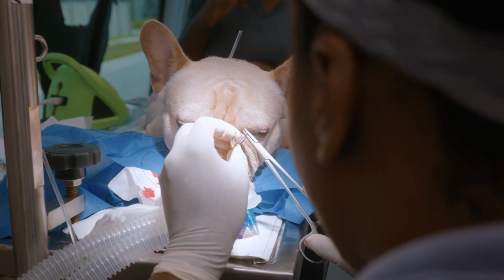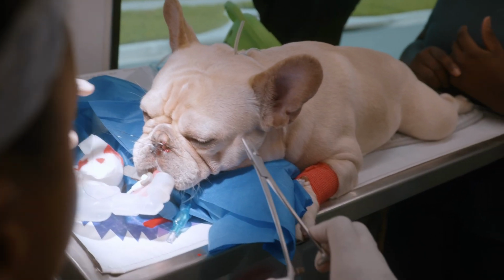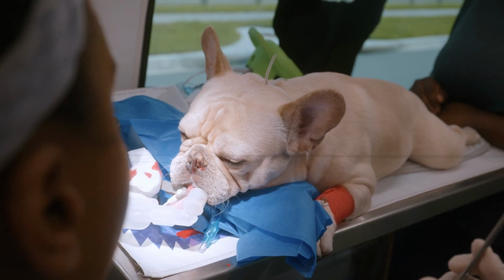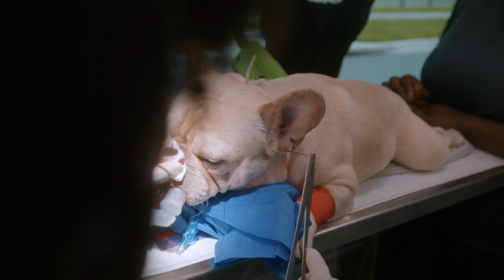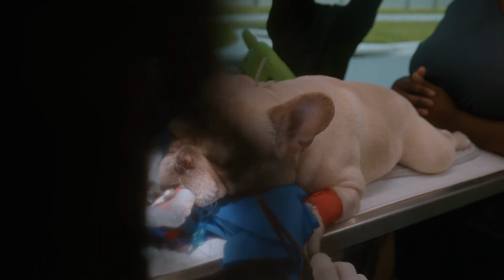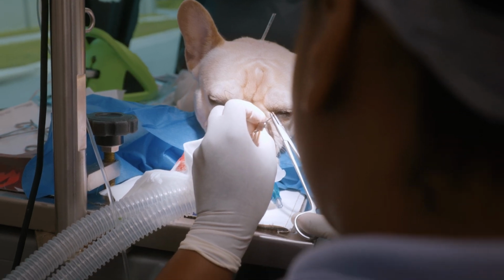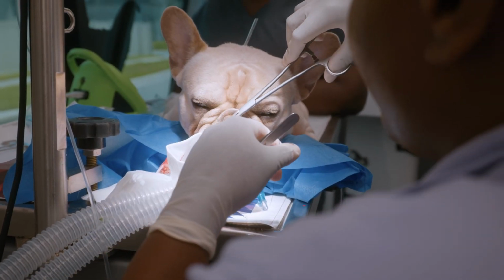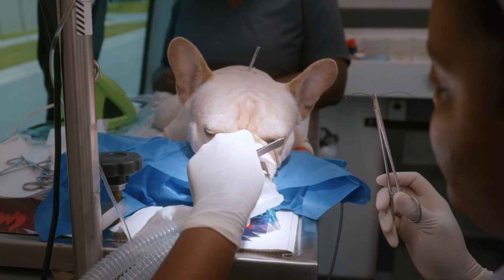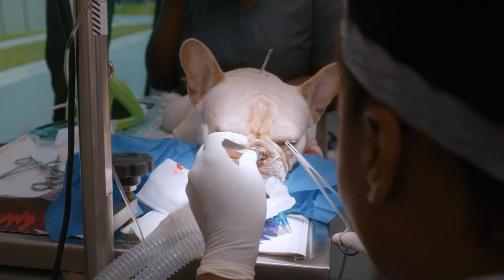You don't want to cut too large of a wedge because you don't want to pull too much from his nostril, but just enough for it to have a better opening than what he had before. I'm leaving a little tag so that I can come back in a few days to cut that out, because he doesn't really like his face touched a lot or messed with, or his neck. It's easy for me to just trim it and pull that suture right out so he won't be so stressed about us touching his face. It's a little inflamed just because we just cut into it, but overall it's starting to look good already.